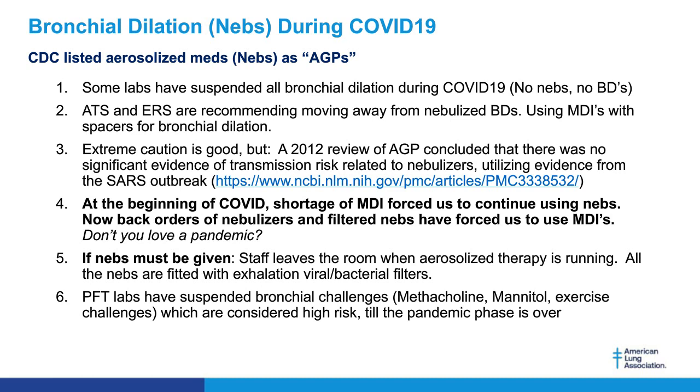What we're doing in my laboratory is that if nebs must be given, I ask my staff to leave the room when the aerosol therapy is running, just in case it is aerosol generating. In other words, we get it all set up, we turn the neb on, we hand it to the patient, and we tell them, as soon as we leave the room, put it in your mouth and begin your neb therapy. I'm also putting exhalation filters on all of our nebulizers. They're viral bacterial filters, so when patients are breathing through the neb, everything that comes out of the patient goes through a one-way valve and an exit filter, a viral filter, too.